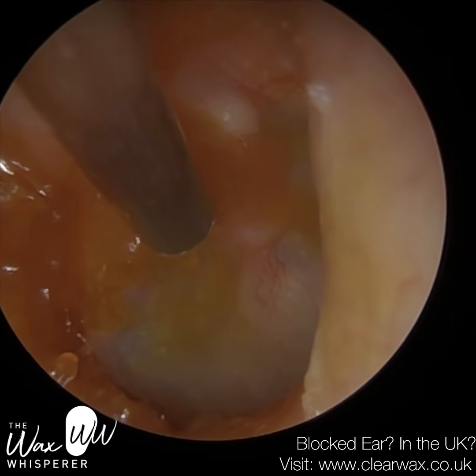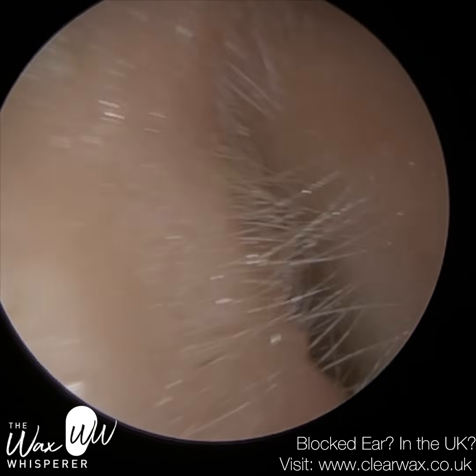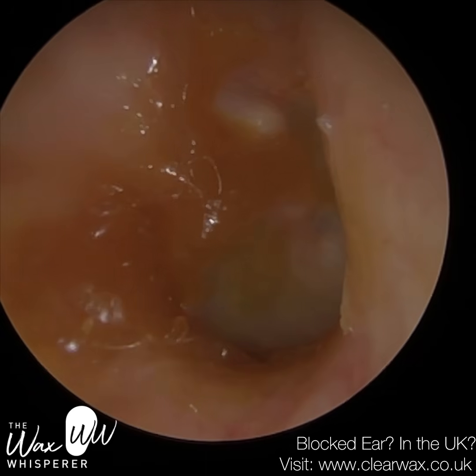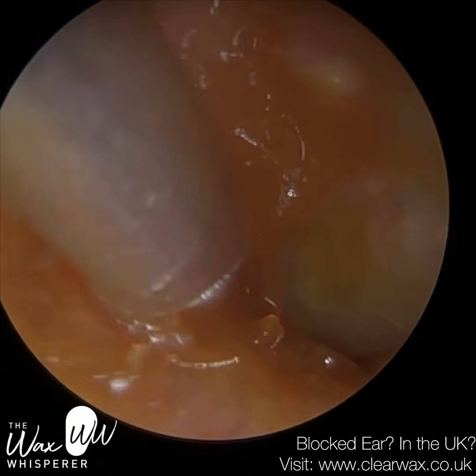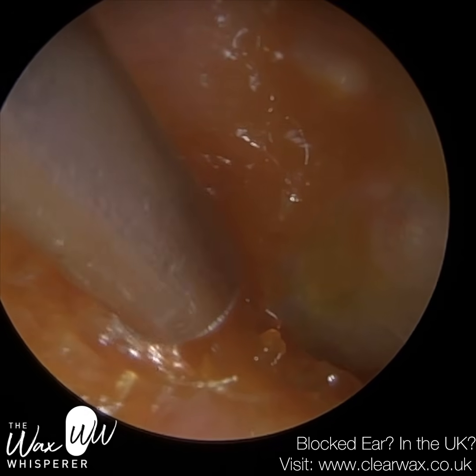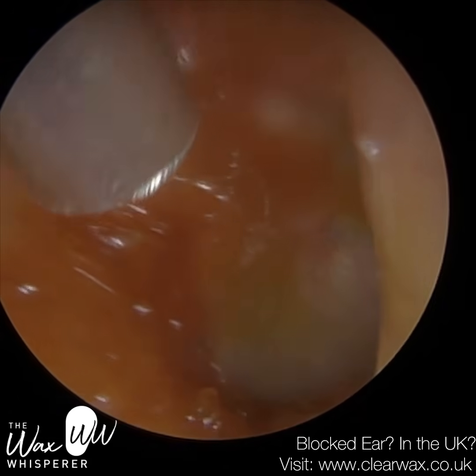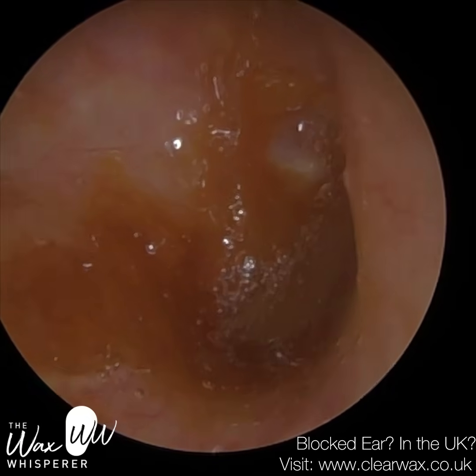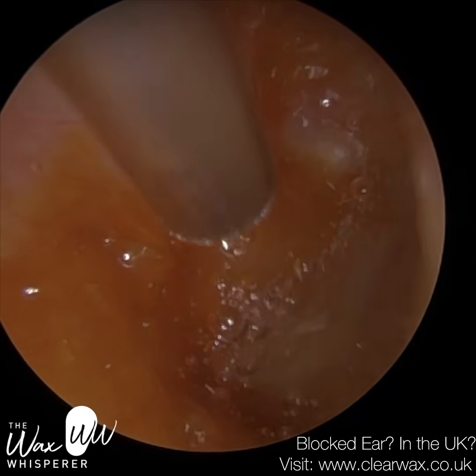So I'm just hovering over the eardrum. There is going to be a bit left, so don't send me any harsh words, please, or emails that sometimes we do get. I don't want to perforate the patient's eardrum, and I just hovered over. If I did any more, it means me really penetrating against the drum. So this bit of wax is not really going to cause any issues. I do get a lot more out, so it's going to be a bit cleaner. Just put another layer of drops just to see if it can soften this sticky wax keratin that's stained on the drum.